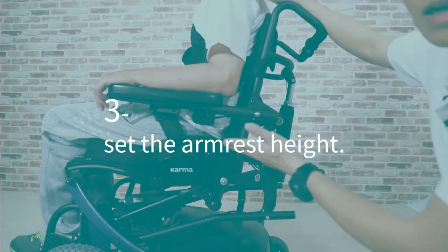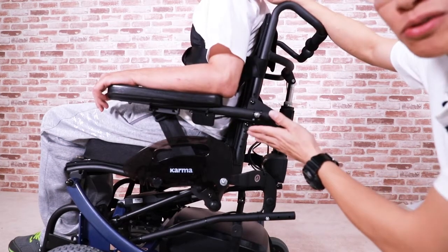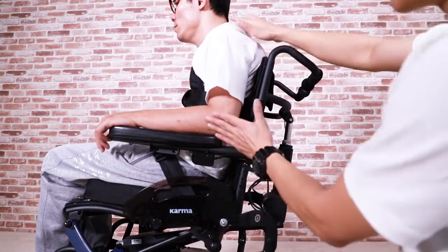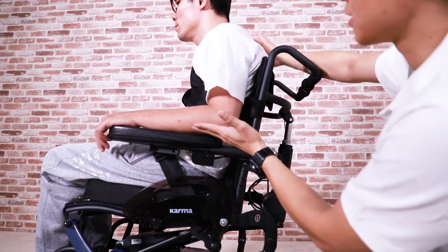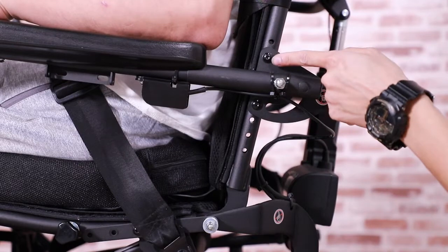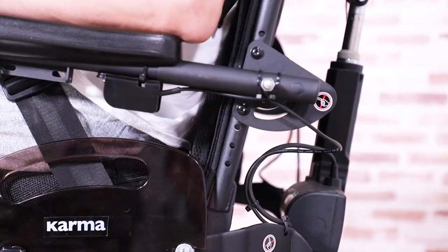Now, we set the armrest height. A good armrest height can help the user to relax his shoulder, both in the sitting and the standing position. Here, you can see that the armrest height is at a suitable position, therefore his shoulders are not too stressed. Ergo Stand offers 5 different armrest heights. You can choose from 20 centimeters to 28 centimeters.